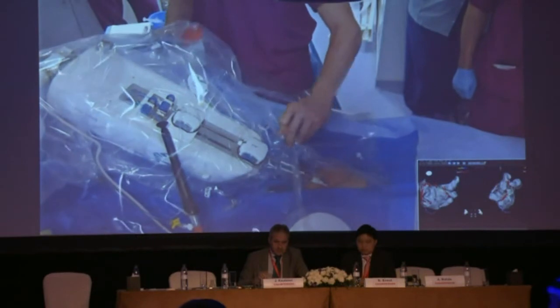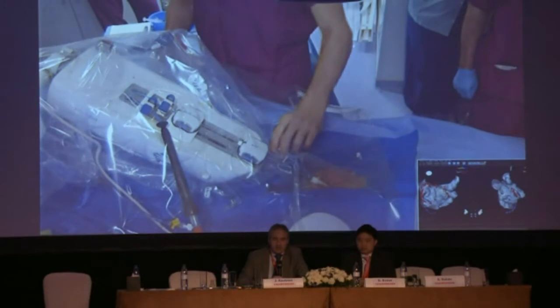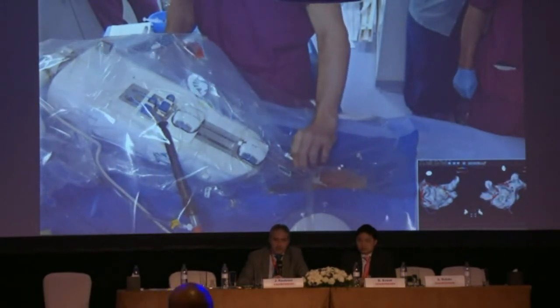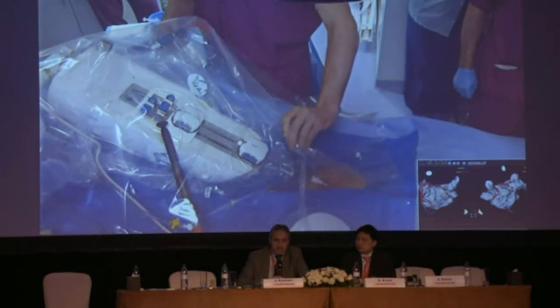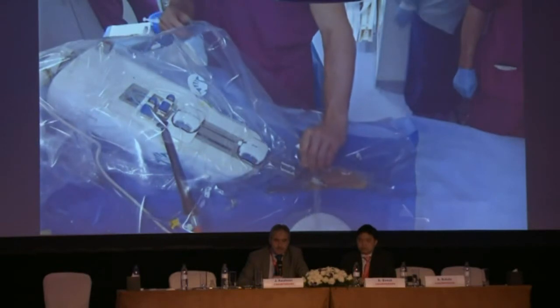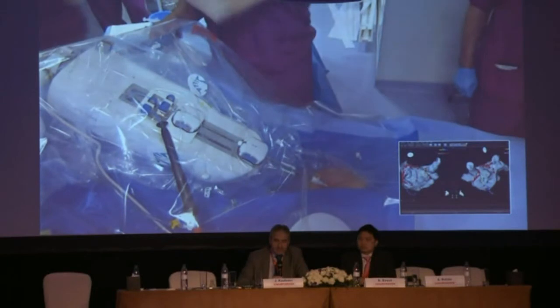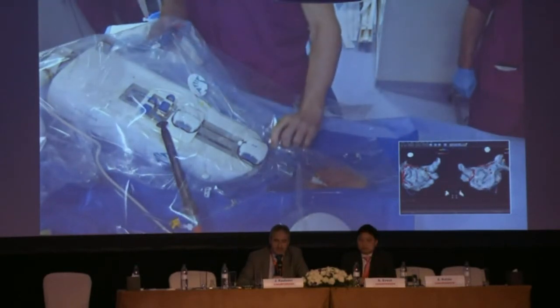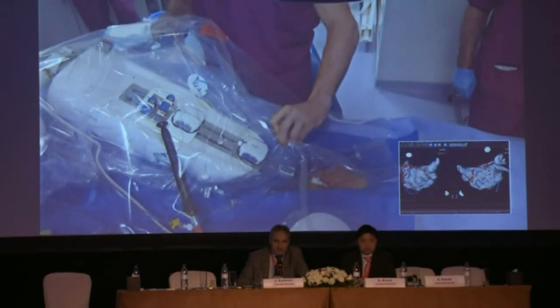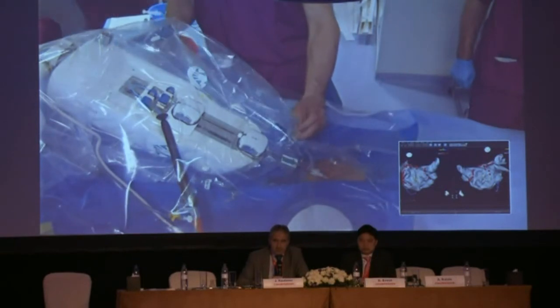Okay, so you can use this when there's a certain amount of organization in your atrial fibrillation. And what do you do before that really gets organized? If you're not organized, if it's complete chaos, then I agree. You go to the areas which you know are going to be the culprits, like the ridge between the veins, the septum, and you just have to do a complete map to see where the fastest signals are.